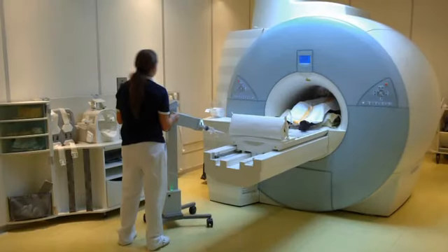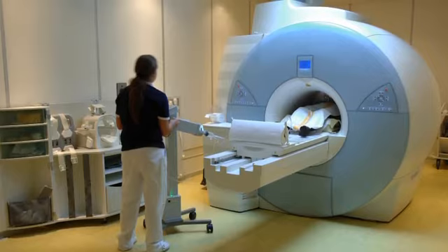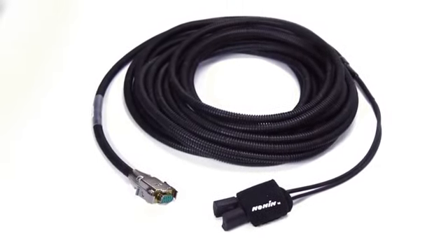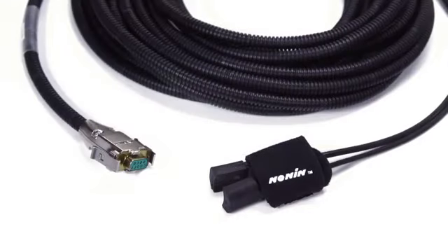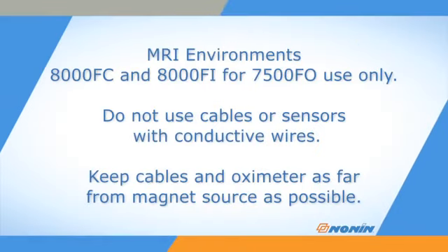The 7500 FO model for MRI environments requires special caution for use. Use only Nonin-branded 8000 FC or 8000 FI fiber optic sensors. Do not use cables or sensors that contain conductive wires. The 7500 FO oximeter and the connectors for the fiber optic sensor contain ferrous material and must be kept as far away from the magnet as possible at all times.